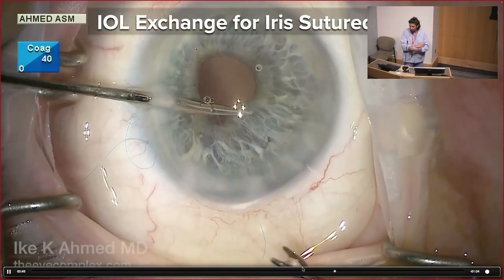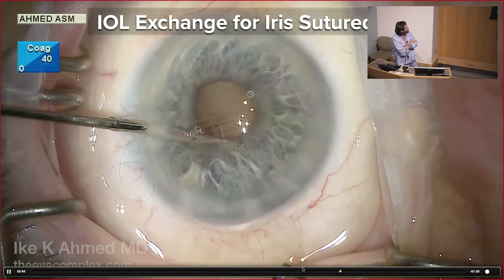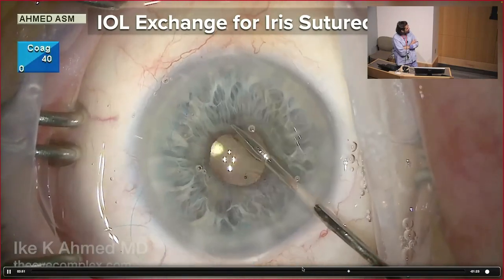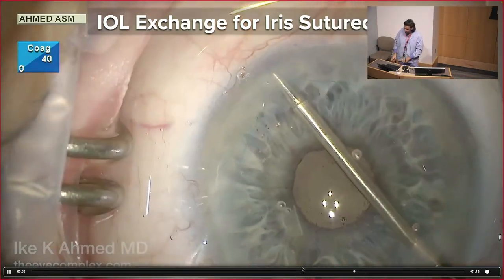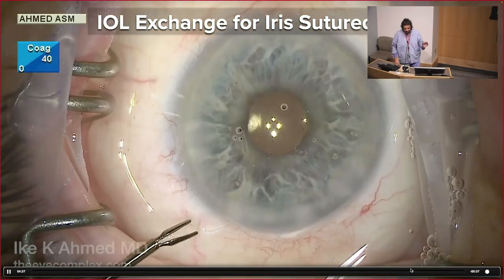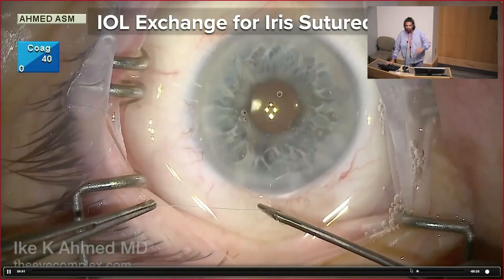Pupil ovalization is not ideal. It's the reason why I've seen some surgeons abandon iris suturing, amongst other reasons. Like any other approach, this is technically something that is a learning curve, but you can see the pupil now is beautifully round. Now we can cinch the knot and then lock the knot in place, again, using whatever approaches we use. And it's all done, again, minimal vitrectomy, nearly physiologic, not quite, and without any external manipulation or anything else.